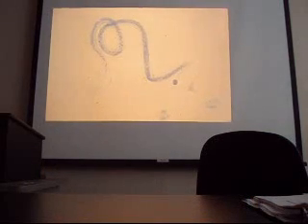Elephantiasis, Wuchereria bancrofti. And is this sheath or not? Yep, do you see parts of the sheath? Okay. Very good.